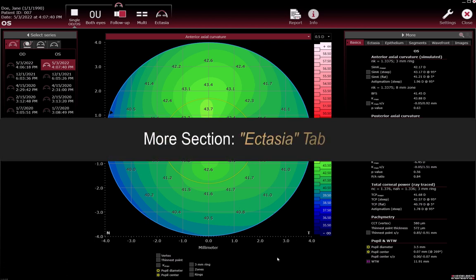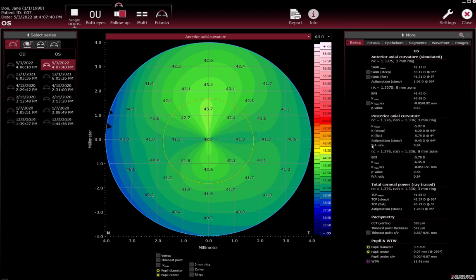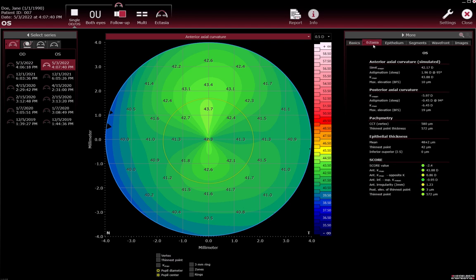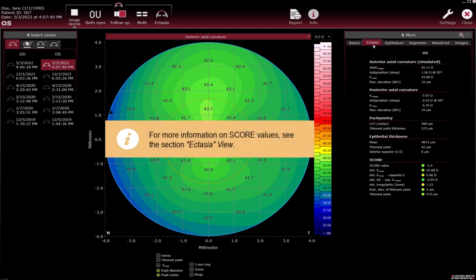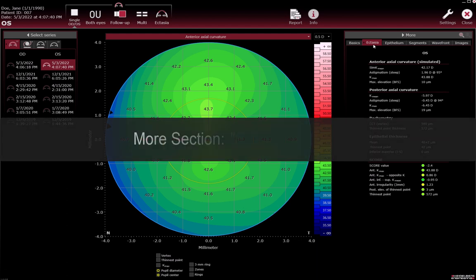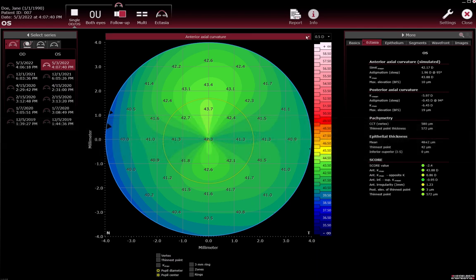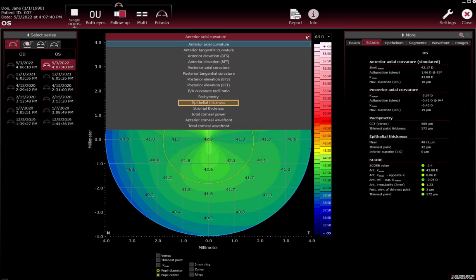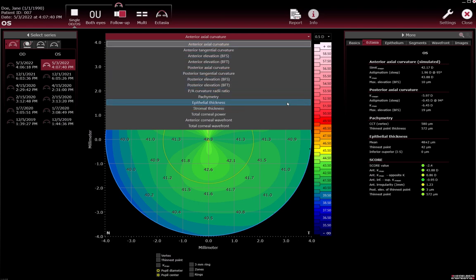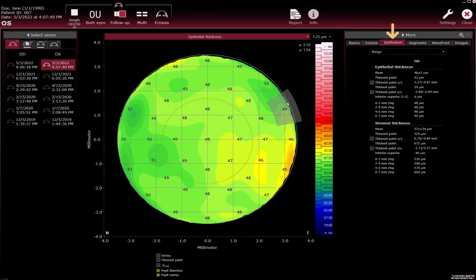More section Ectasia tab. Basic ectasia parameters are available in the Ectasia tab. For more information on score values, see the section Ectasia view. More section Epithelium tab. Choosing the epithelial thickness or stromal thickness map automatically selects the Epithelium tab.